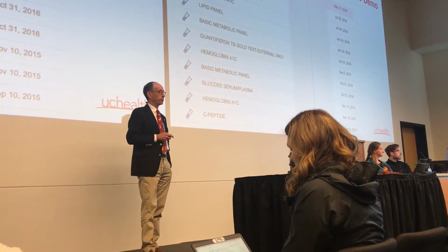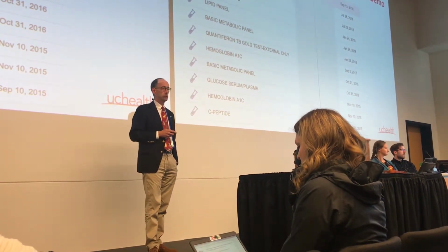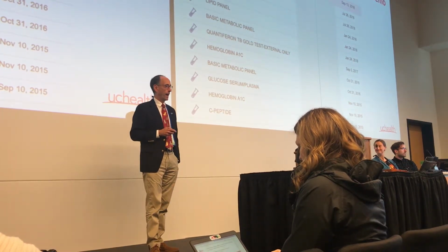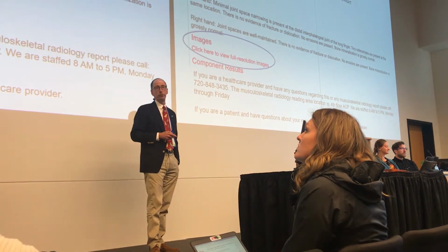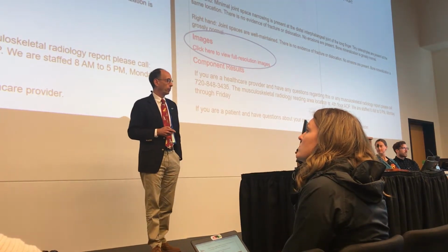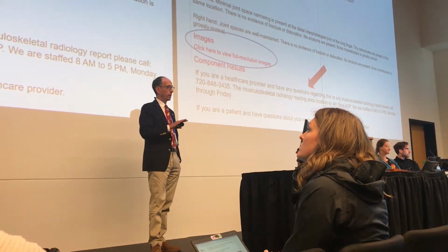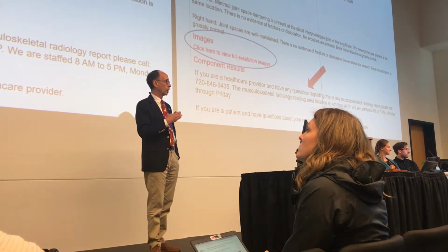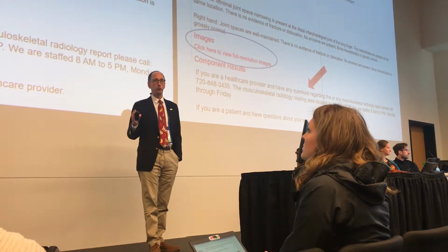You've seen a slide of this before, but on MyChart, if you go to your test results and you have had imaging studies done, they'll be denoted by the chest skeleton, yay chest. And when you click on that, you're taken to our radiology report, which now has the click here to view full resolution images, which is a Subi link. And I will point out that on all radiology reports at UCHealth, we also embed verbiage, as you see here. If you're a healthcare provider, it provides a phone number to call the radiologist if you have questions. If you're a patient, you're instructed to call your provider.